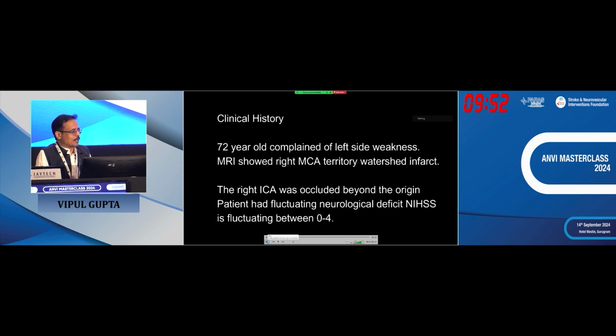Okay, let me talk to that, and practically, I'm just not... It's a great ACOM. I checked the venous delay. There was no venous delay on the other side. To me, like in carotid occlusion, yeah, we won't stent it, number one.